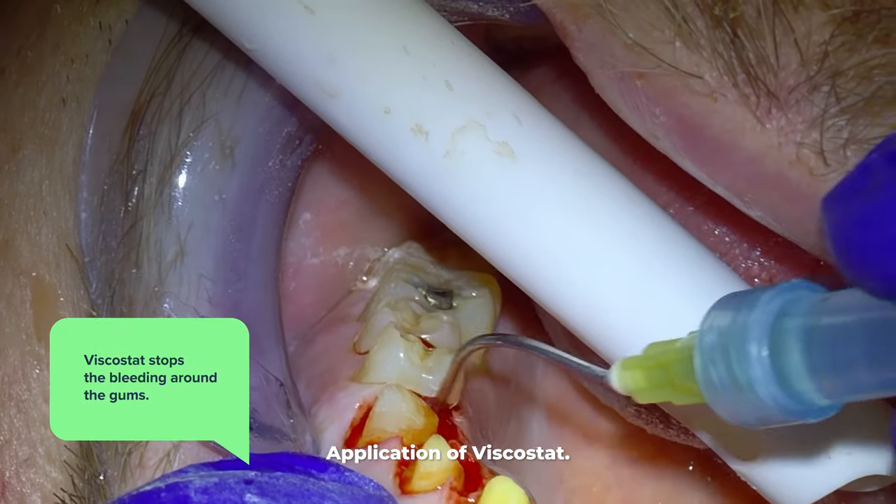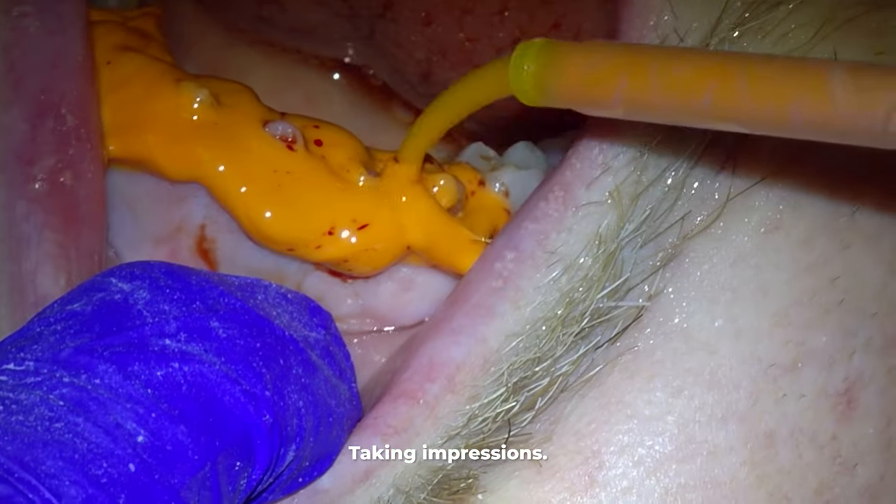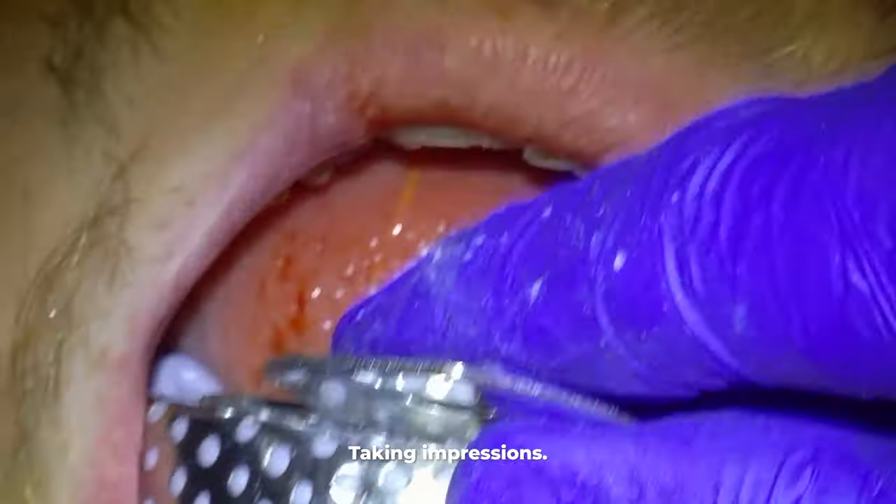Once most of the bleeding has stopped, we then take an impression. The impressions have two layers: a bulk layer, which here is the purple, and a fine layer, which is the orange here, to pick up the details of the teeth.